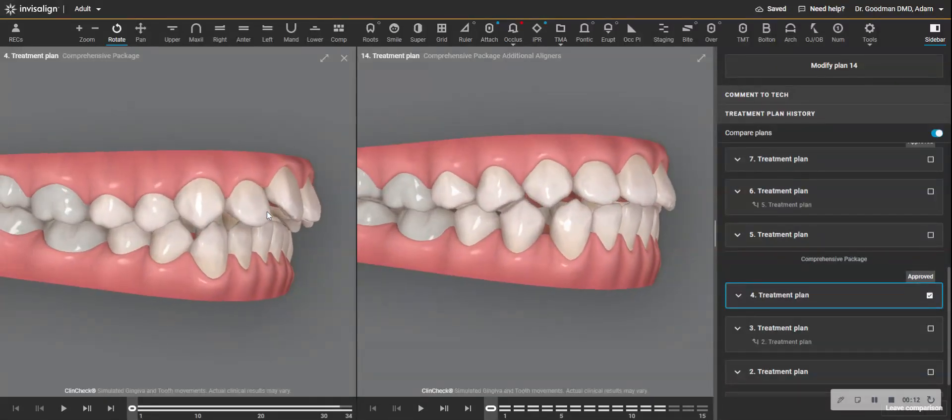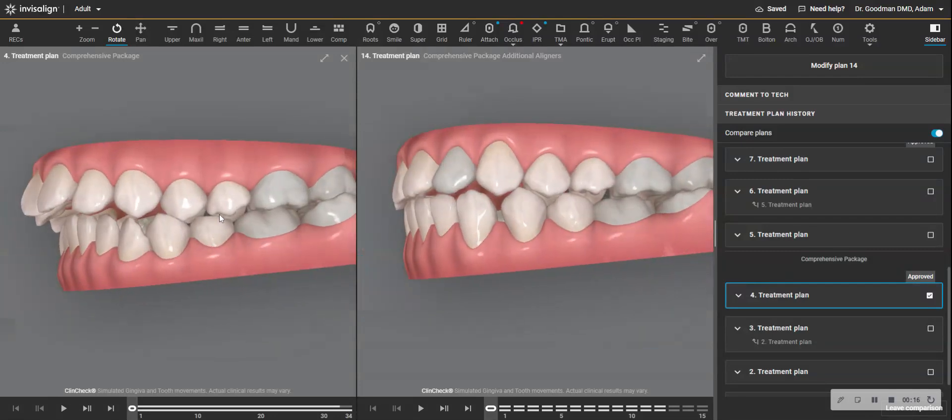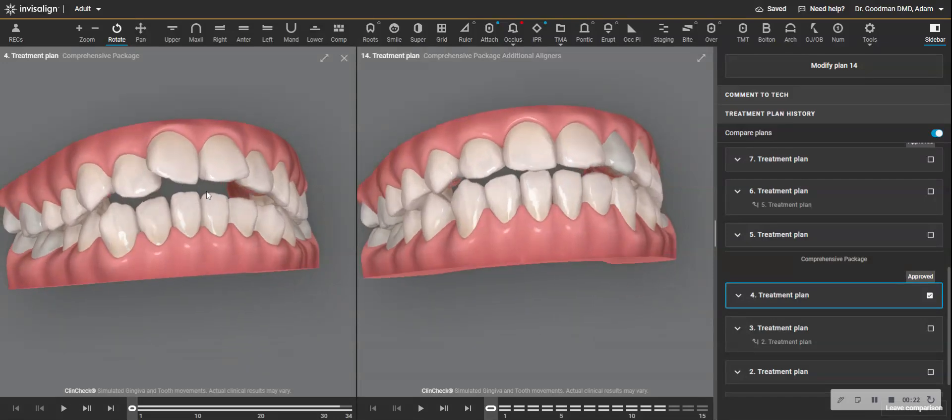We see there was a lot of overjet, but it was deceiving because it was Class I bilaterally. So that tells me that we have dental retroclination of the lowers, flattening of the arch, and a dental protrusion.